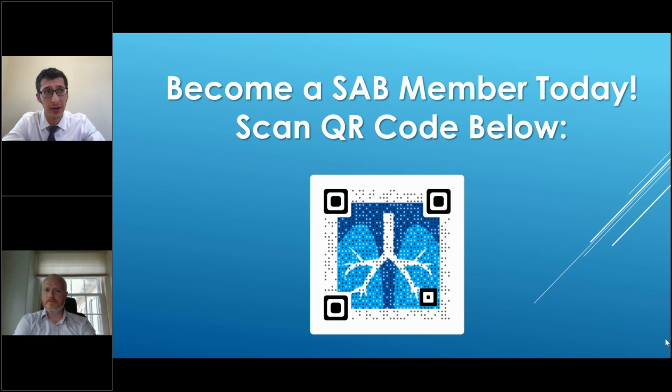And I think the other, I have a question for you about mobile cone beam use and how you've incorporated that, but I'm sure you've had cases where you're using imaging and you can put your first needle out and it makes a little bit of a mess and you have trouble getting a crisp image again. And so I sort of felt over time that if that was going to happen, I'd rather at least have a big piece and have my first, if I make a bloody mess, at least it's with a cryo probe.